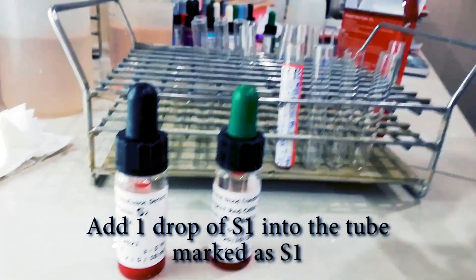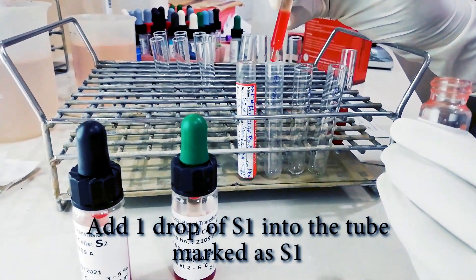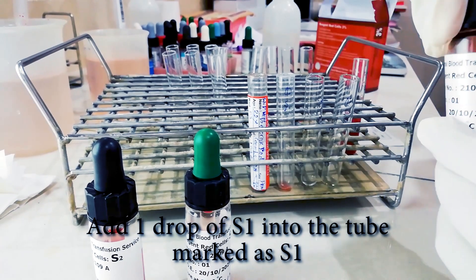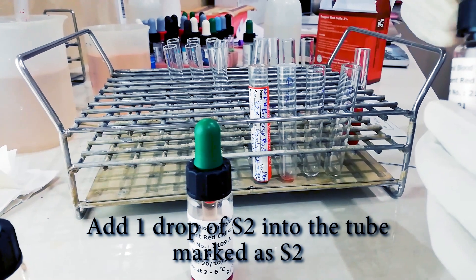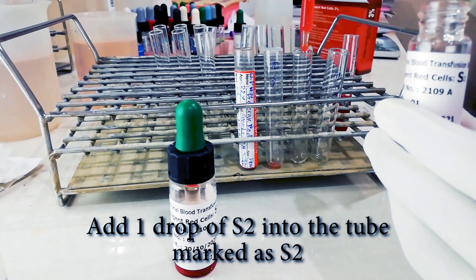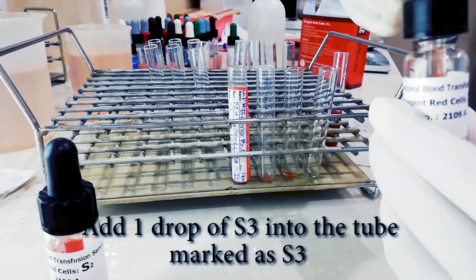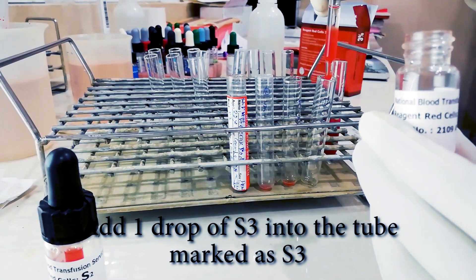Then we will add one drop of reagent into each tube. We add S1 reagent into the tube labeled S1, one drop. Then we add S2 into the tube labeled S2, one drop. We add S3 cells into the tube labeled S3, one drop.